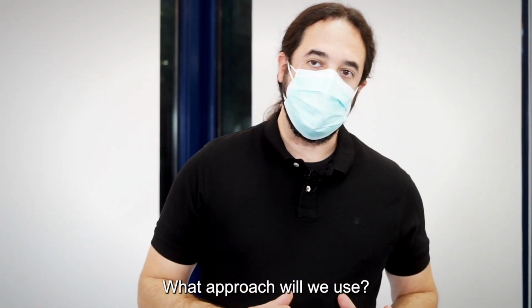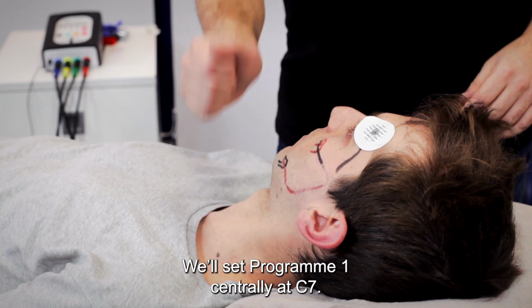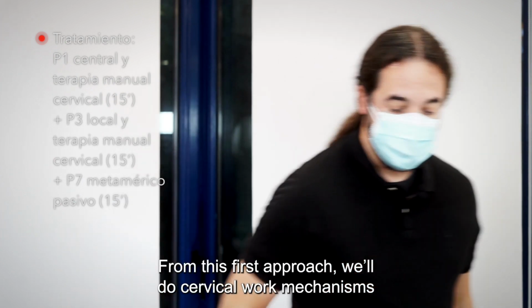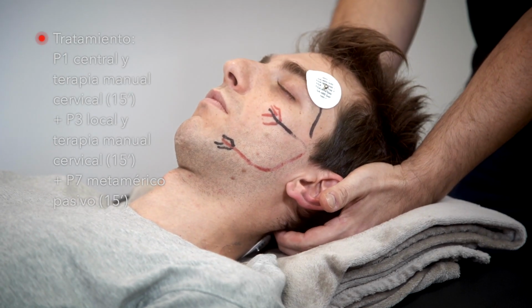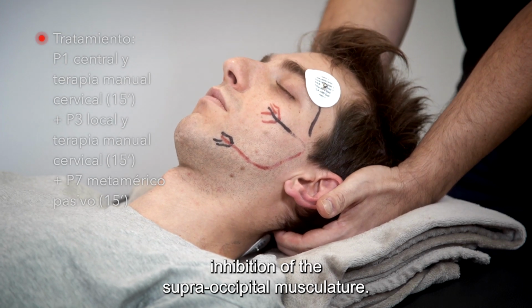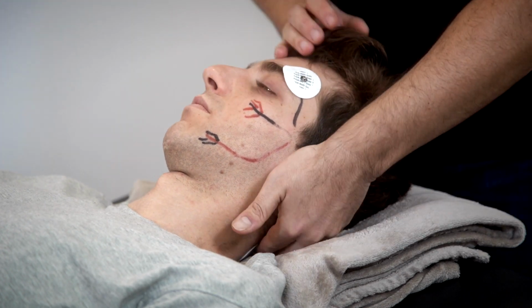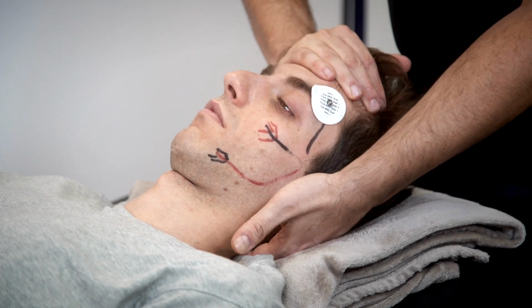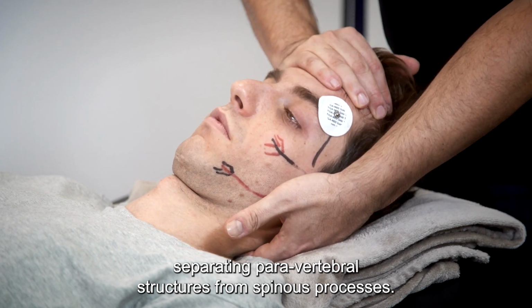So what will be our approach? We'll set program 1 centrally at C7, and from this first approach, we'll do cervical work mechanisms at the level of inhibition of the suboccipital musculature. Muscular dissociation work, separating paravertebral structures from spinous processes.